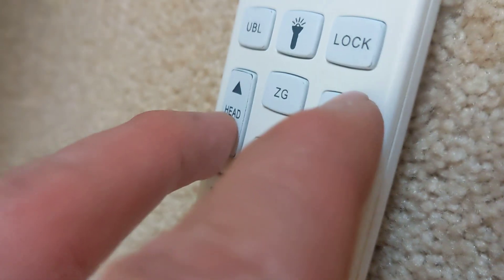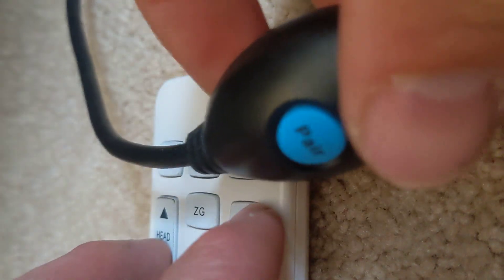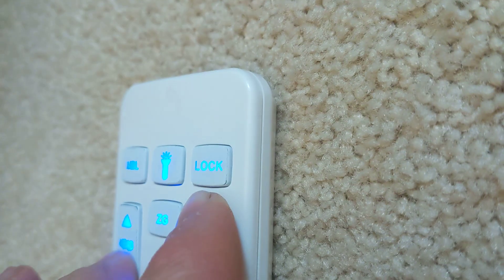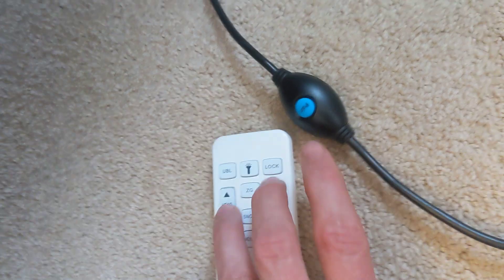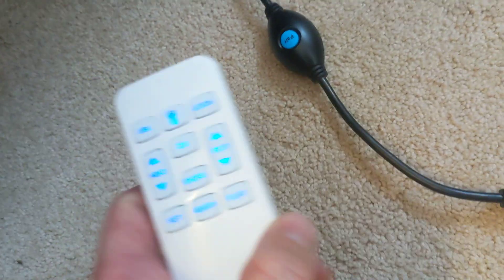Sorry, trying to do this all with one hand. You got this blue button here, so we're gonna press head down, foot up, and press the pair button. Once you hear that beep, that means everything is paired correctly. Again, that's the head down, foot up button along with the pair button.